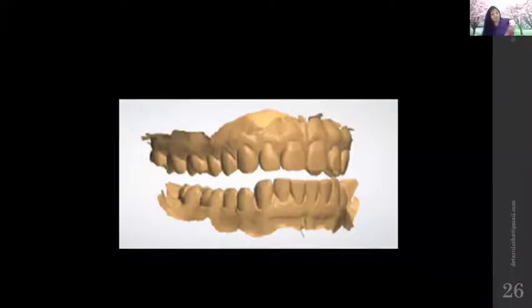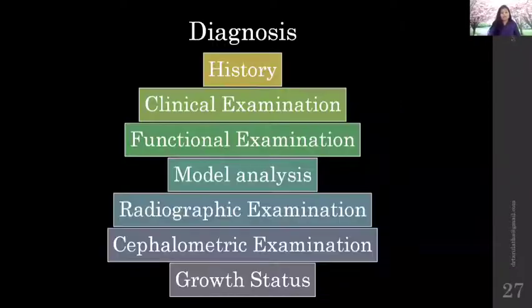All these things you check in the model by bringing the mandible forward like this, and by this you come to know whether you are encountering a positive dental VTO or negative dental VTO. If you have a positive dental VTO, go ahead, you can always give twin block in such cases.